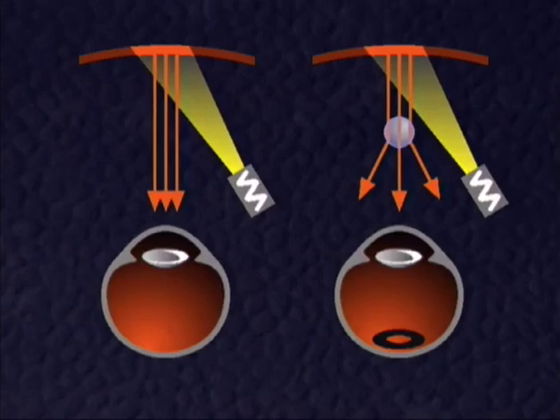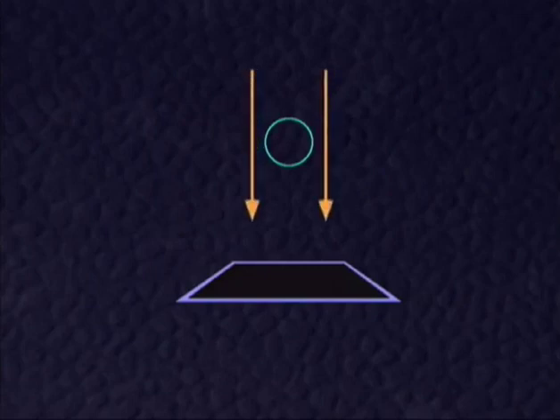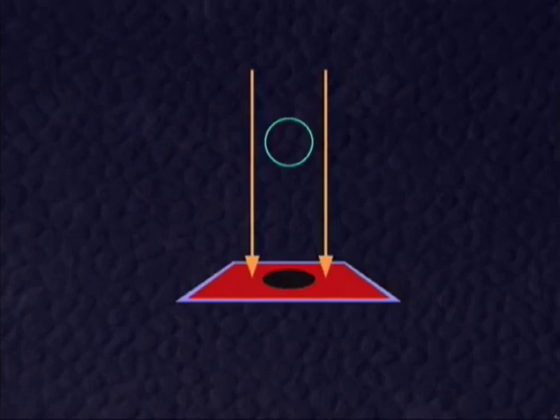How does this occur? Consider the existence of a spheroid obstacle with an index of refraction differing from the ambient medium. Backlight will pass beside the sphere directly to the observer. Backlight will also pass undisturbed through the center of the sphere. The peripheral rays, however, are bent.